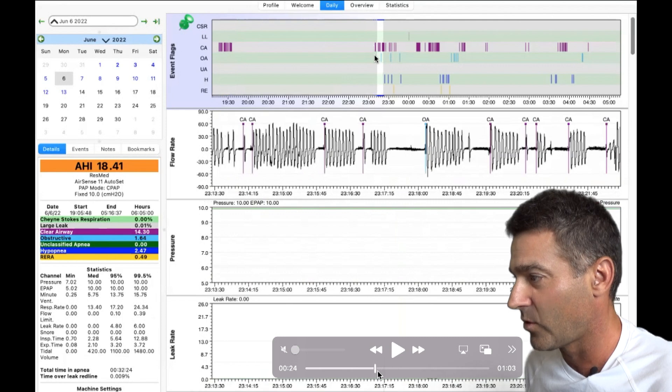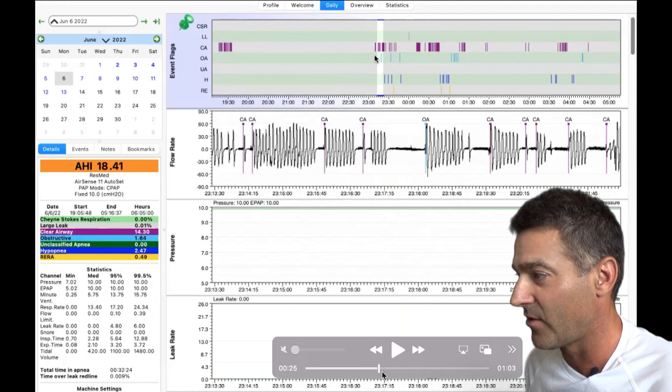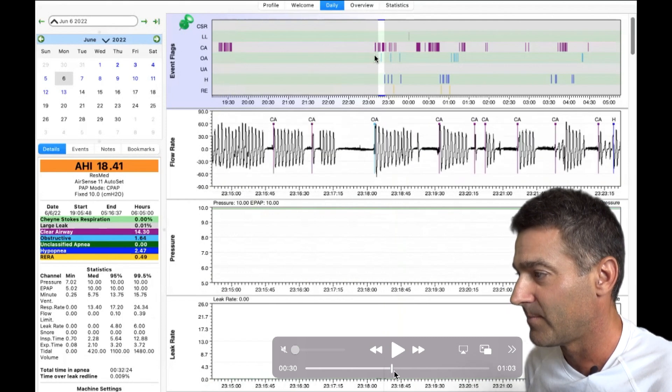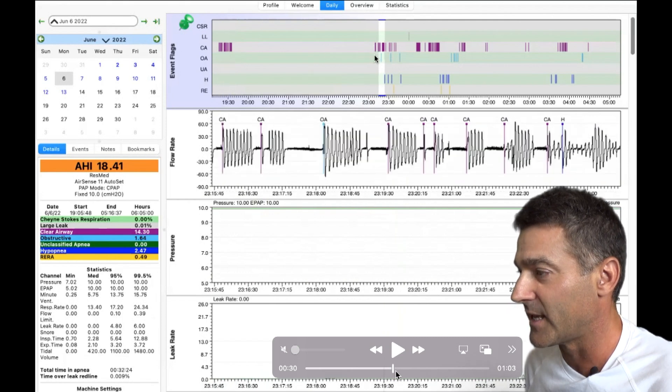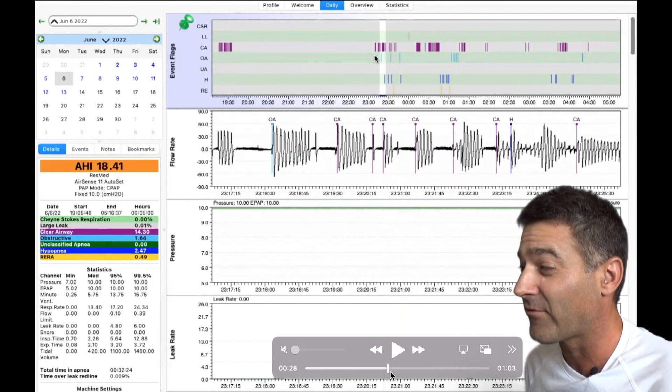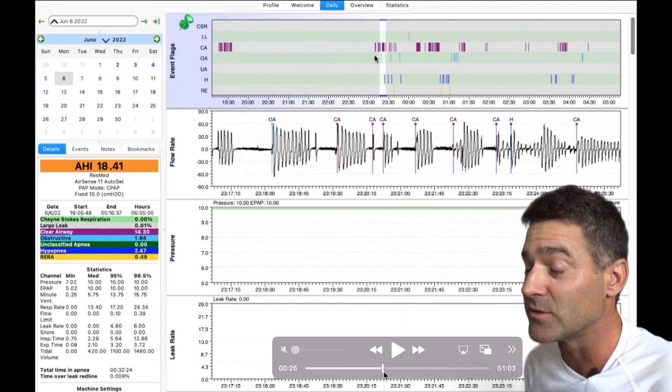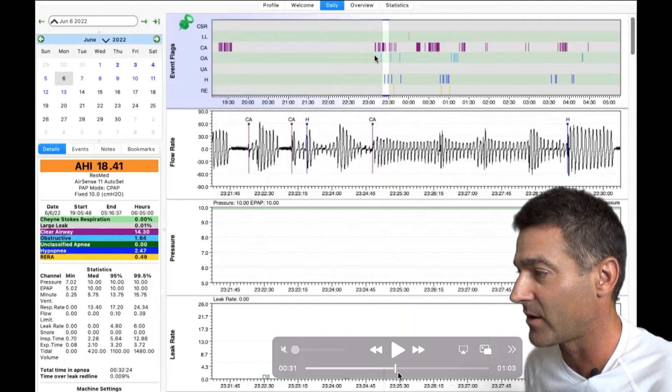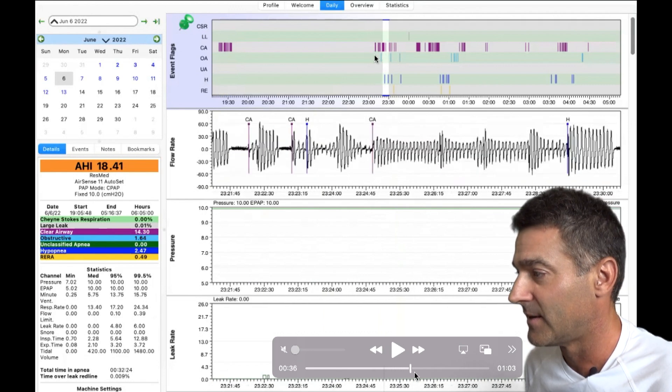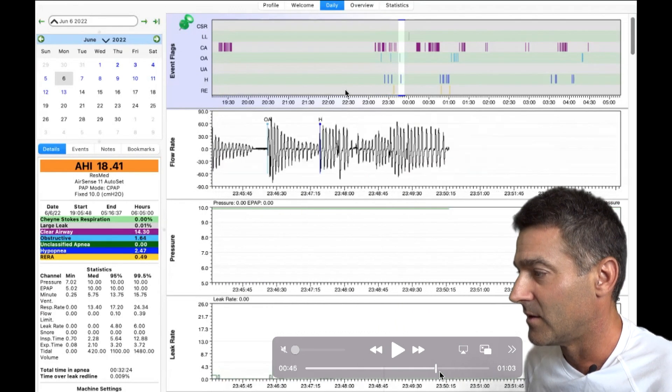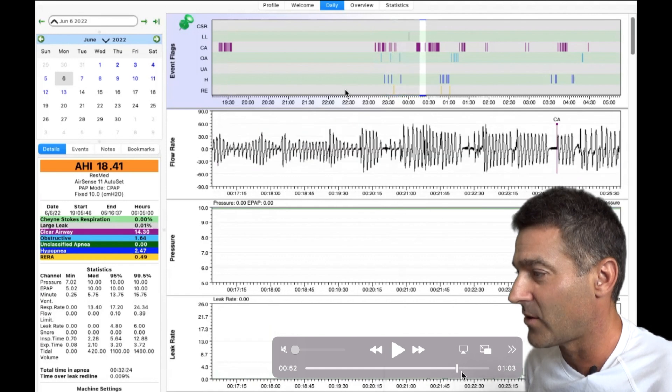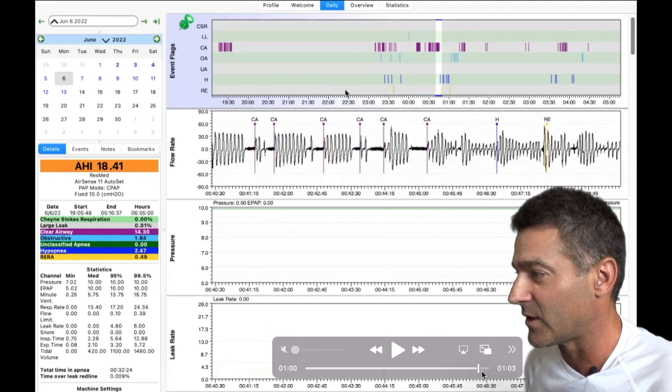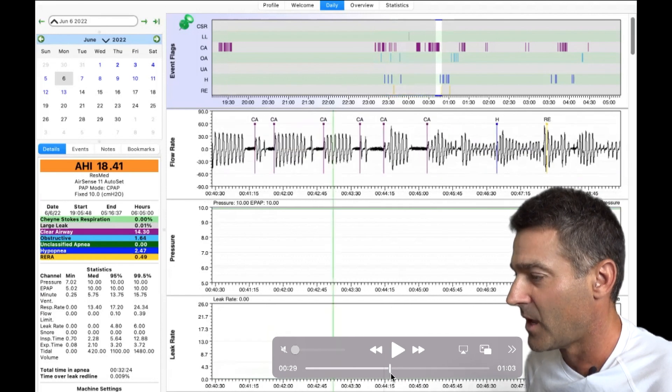And then if we go forward, we have another period where it's occurring again. Now this was after he got up and used the restroom. Keep that in the back of your mind. We also have some other interesting things in here, which I'll get to in a minute also.